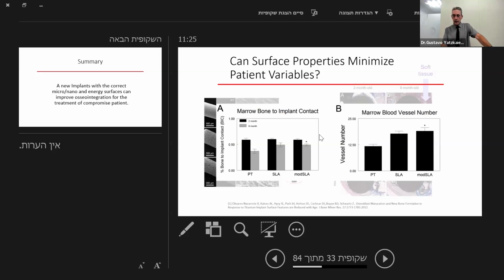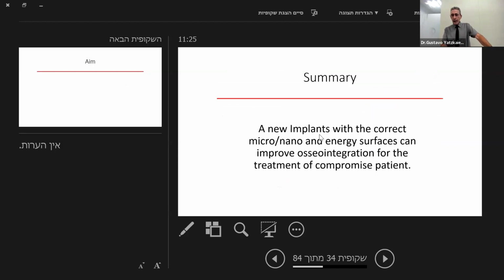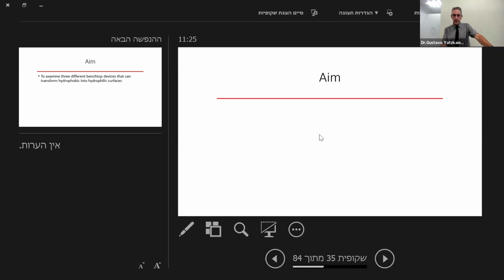At this time, it's important, I want to share my own experience with my failures. I saw that my failures occur more in compromised patients, compromised areas, or when I stretch my boundaries. And this is the goal of using hydrophilic surfaces.